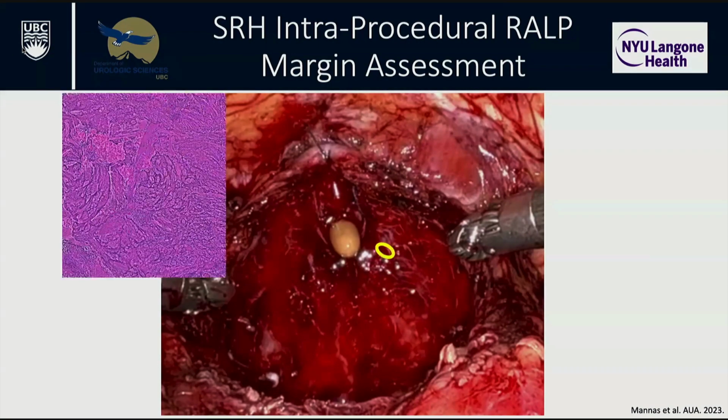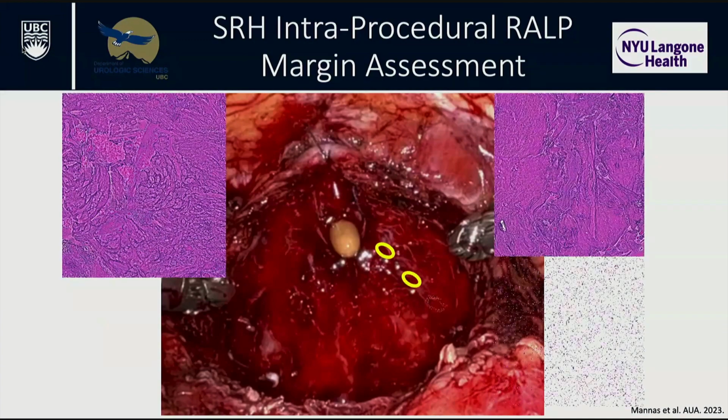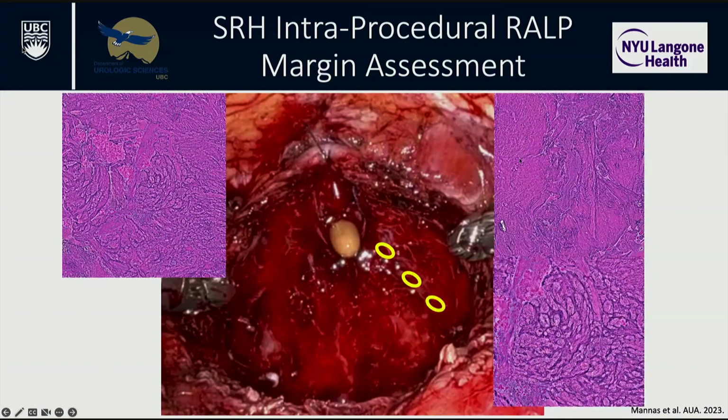And so what we did was we took biopsies, and we started looking at them in real time. This is a biopsy. You can see there's prostate cancer in that surgical margin. That's benign, and there's more cancer. The difficulty here, at least in my interpretation, was how the nerves look on end. When you have a nerve like this, it's easy to tell it's a nerve and not cancer. When the nerve's actually on end, it looks very similar to glandular morphology.